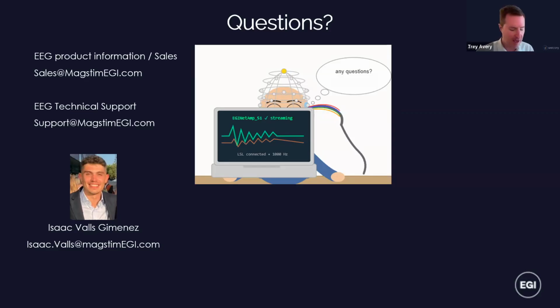And LSL is capable of synchronizing both wired and wireless devices, correct? So someone could connect, say, a wireless health tracker of some sort, and then sync that via LSL with our network-based connection, right? Yeah, that's correct. LSL handles all of these synchronizations over the network.